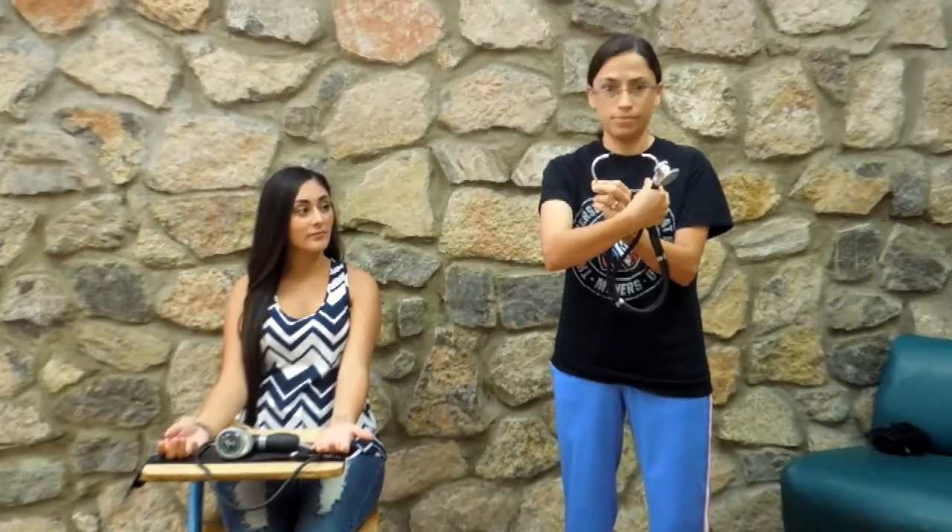Make sure the stethoscope's earpieces are not facing towards you, but away from you. This part right here is called the diaphragm.